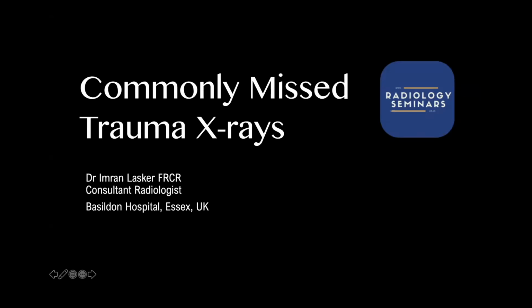Continuing from a similar theme on trauma radiographs, musculoskeletal theme, Dr. Imran Lasker, who's a consultant radiologist at Basildon, will be taking you through very much a case-based approach to some of the commonly missed or subtle radiographs in trauma. And this is not really just for radiologists, it's anybody who reviews trauma x-rays. So you might be an A&E doctor, or a reporting radiographer, or somebody who just sees patients with trauma. It doesn't necessarily have to be some major trauma. There's mainly a lot of subtle fractures that people don't necessarily appreciate.